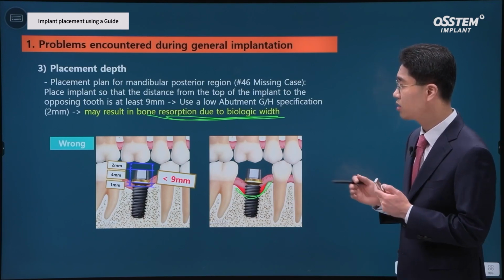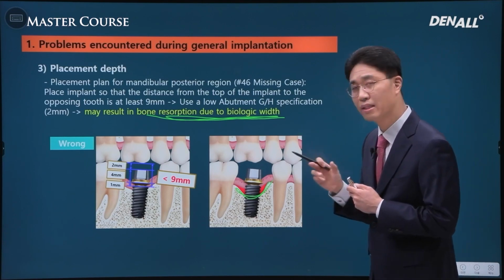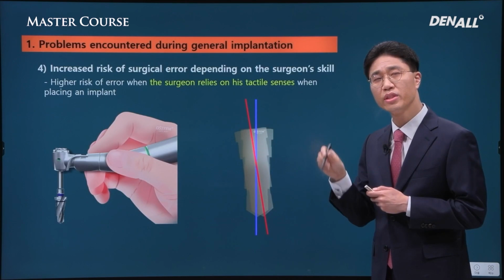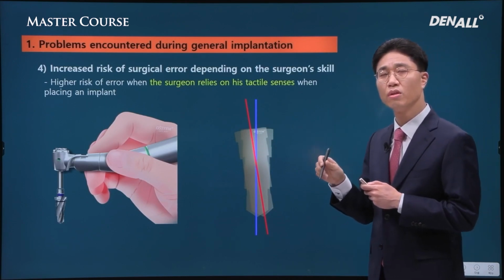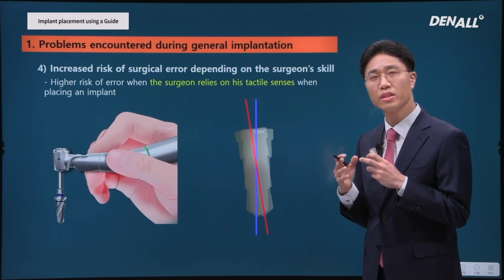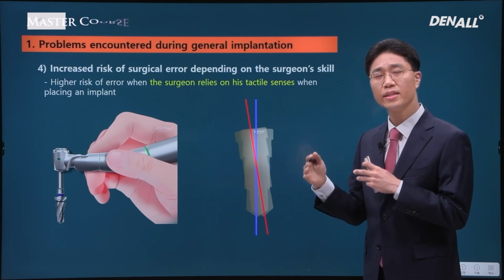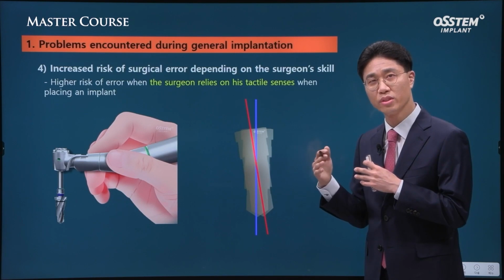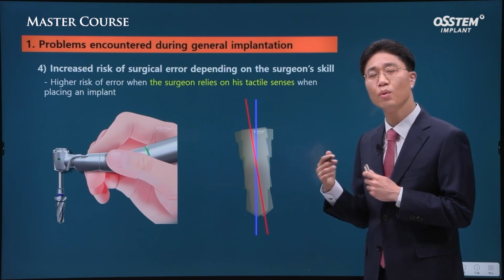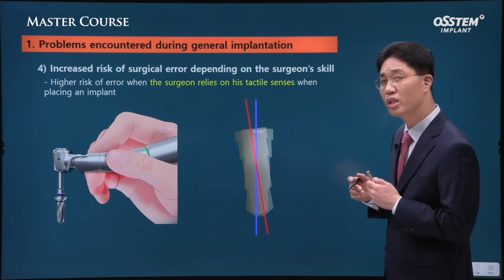Before going into surgery, you need to choose the implant position appropriately and perform implant placement. In general, when placing implant, drilling is used. Since long ago, I've used the analog method to place implants using surgical stent. I fabricated surgical stents and placed implants, but it does have limitations. It's not fully accurate. You need to get more used to it, and with surgical experience, then a surgeon tends to just place the implant based on experience and technique.